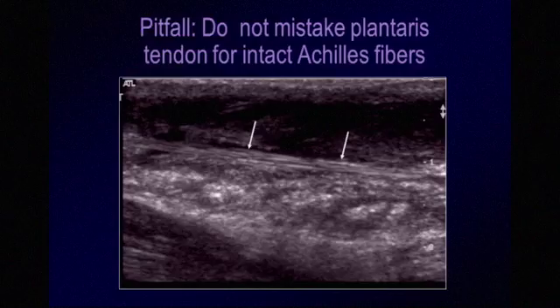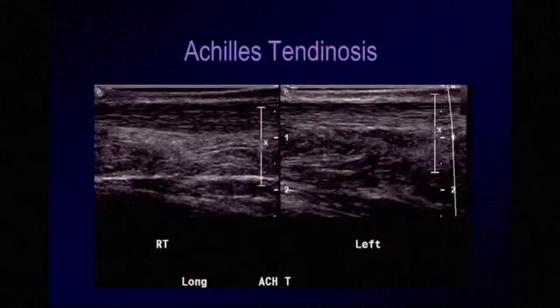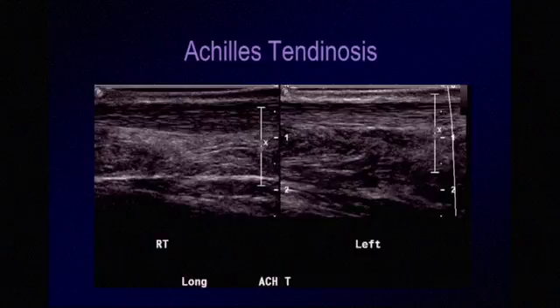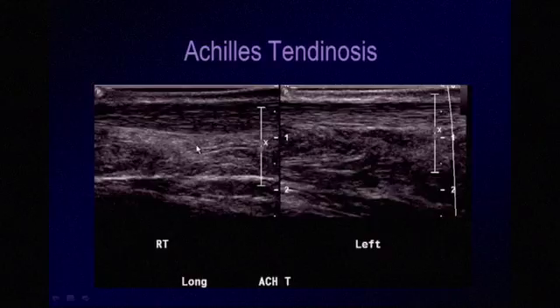Many times you may see a tendinous structure medial to the Achilles tendon — this is the plantaris tendon, which we don't want to mistake for intact Achilles fibers. Tendinosis is another type of pathology that can affect tendons — a chronic repetitive injury that leads to mucoid degeneration and can progress to tears. Here we compare the right Achilles tendon, which is hypoechoic and thickened with loss of normal architecture, to the normal left Achilles tendon. This is a case of Achilles tendinosis.